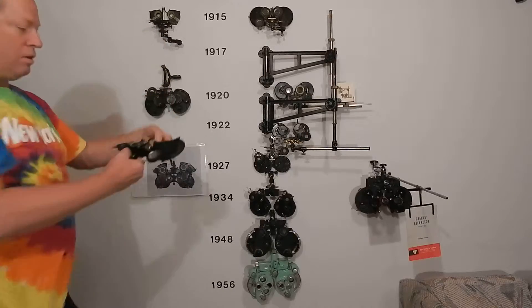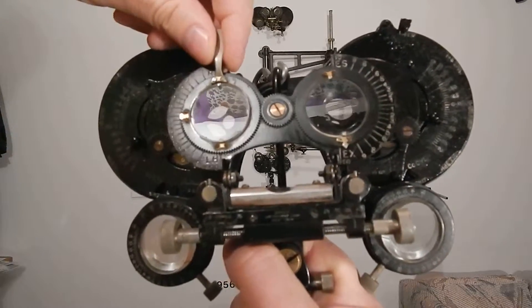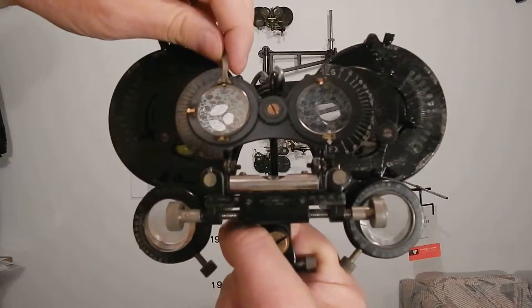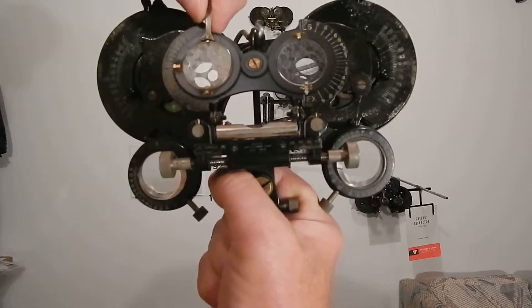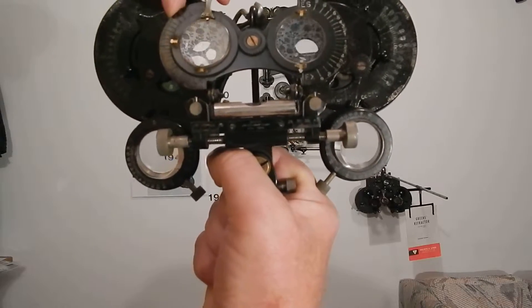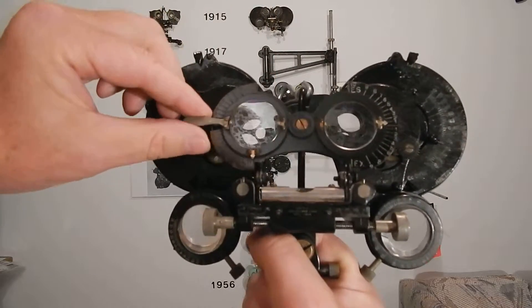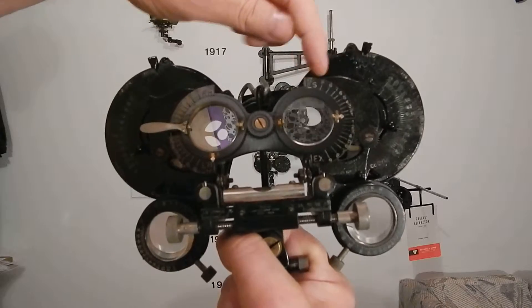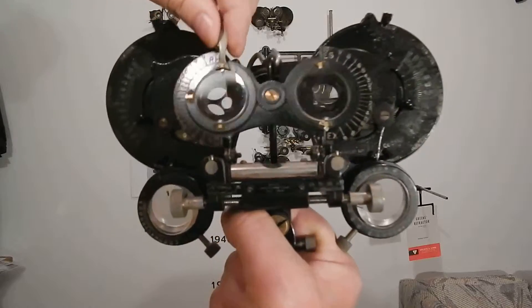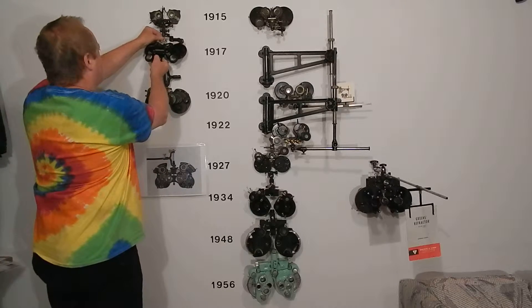The Stevens ferometer is really cool. You can measure somebody's phoria in 15 seconds with this. You put it up here for vertical prism and measure it. It says right hyper and left hyper — you measure it right here. Tell the patient when the two lights are lined up like headlights on a car — although cars didn't have headlights in those days. You move it over here and measure it horizontal for eso, exo, and you read it off that needle. That's how Stevens ferometers all worked — these things all had them.